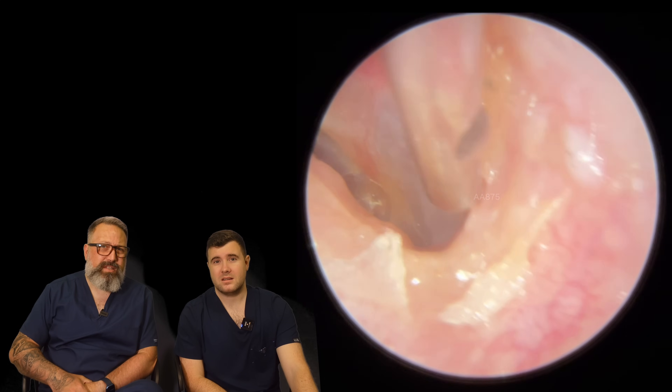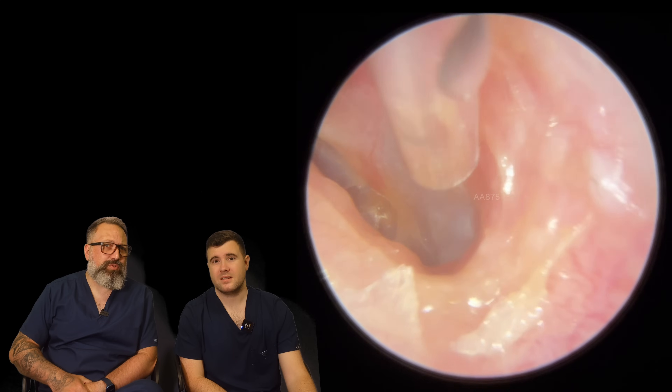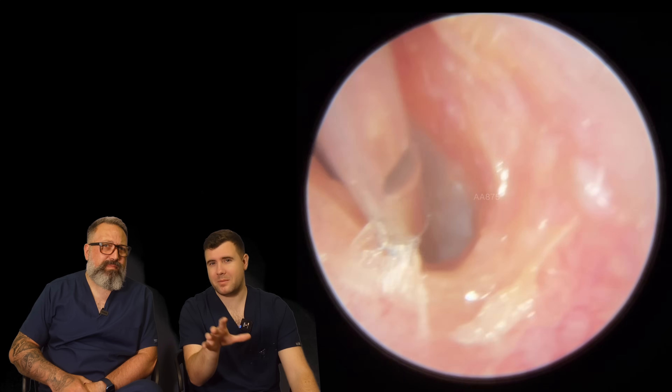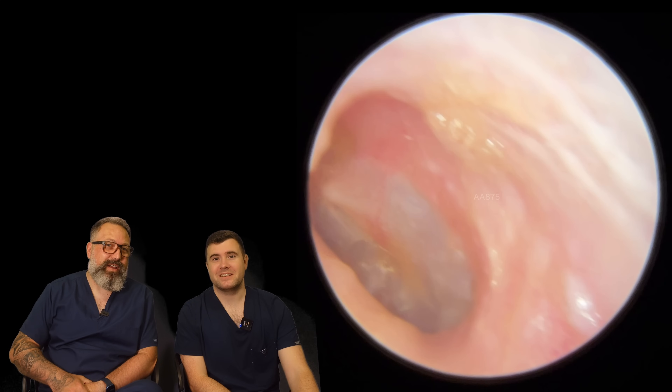Yeah, it's always difficult. These little tiny bits sometimes take longer than the actual wax removal itself. Sometimes you get a lot of movement with the camera because the patient likes to talk to us while we're doing the procedure, which we don't mind.